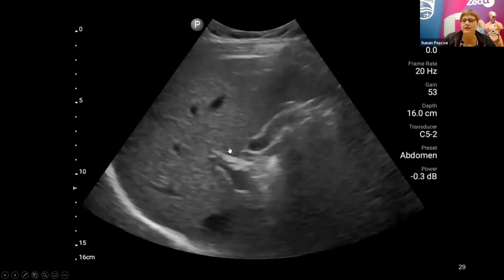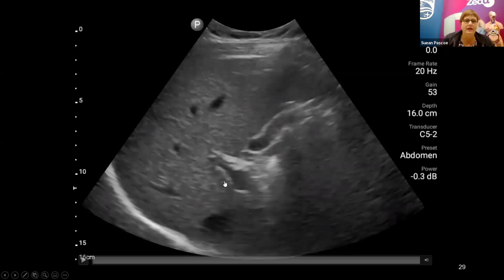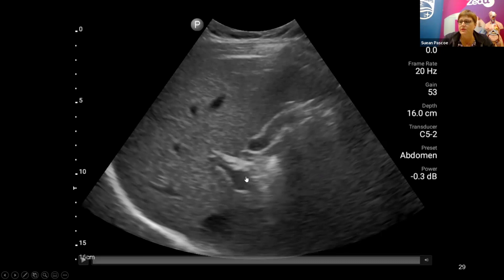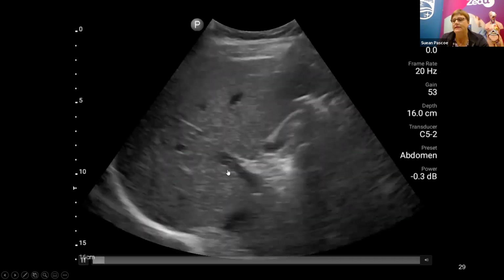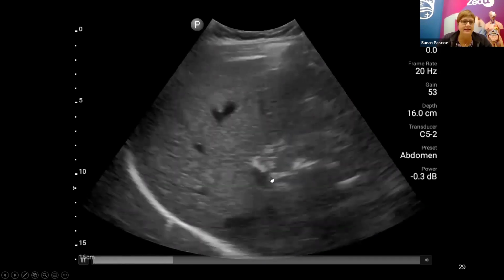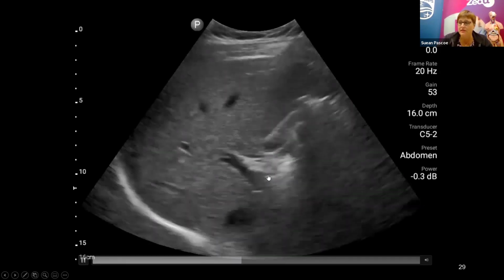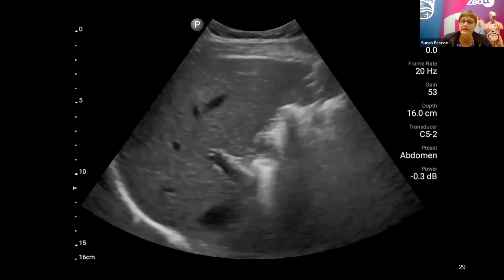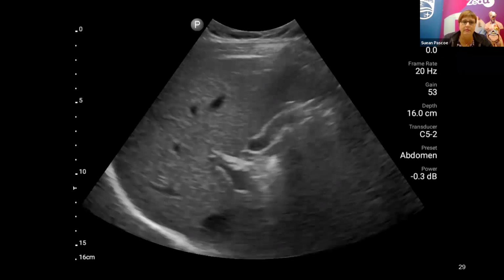I think the key thing to think about here is when you have a completely normal bile duct, they are difficult to see, even on normal people. So if I've had a good look around where the neck of the gallbladder is and where that portal vein is, and I can't see any other structures, then I can probably assume that it's normal. Because in the cases where it is dilated, it's much, much easier to see, and it stands out a whole lot more.